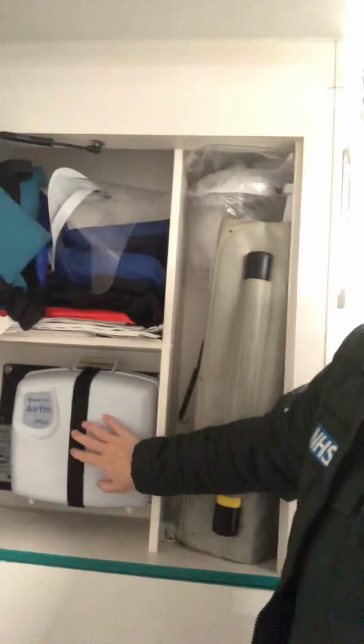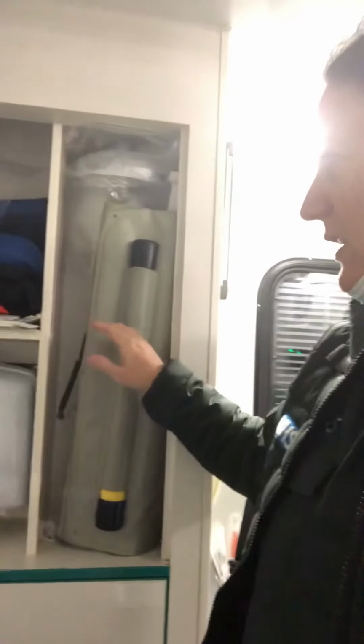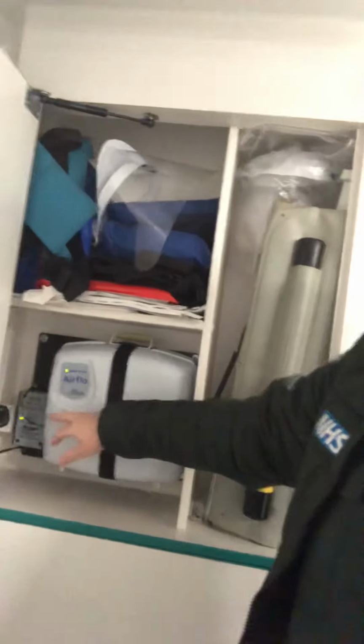If you're in this ambulance, for example, we have our main cupboard here. I am now looking at the back of the ambulance, and this cupboard here, if I open it up, this is your mangar, okay? This is your airflow, which actually is the pump, which will then allow you to put a pipe into this when it opens up. This is where it's stored, and then you obviously can put it back together again, and then plug it back in. So then the battery keeps the pump, in theory, full.